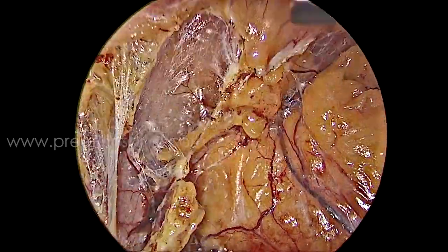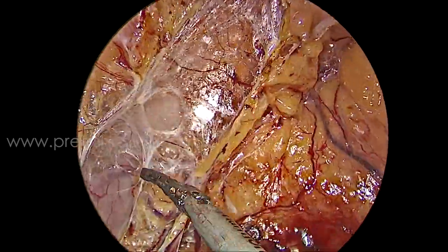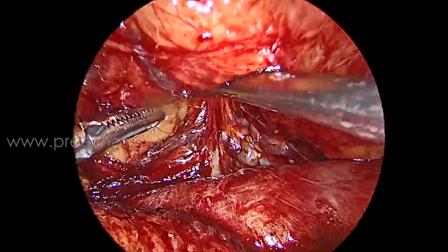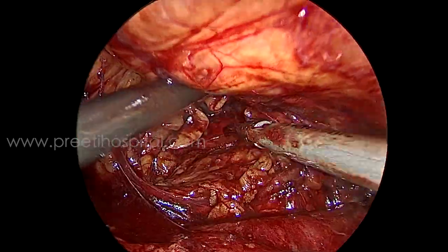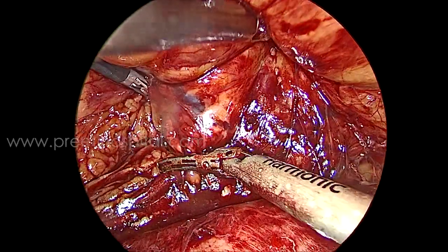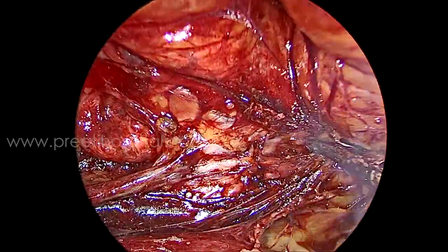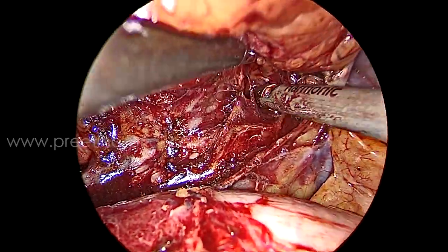All the loose areolar tissue dissected well, nice view, no problem. Identifying the psoas was also okay. Heavy kidney falling to the side was one problem — lifted with one hand and slowly moved. From now onwards a little problem started. This is the renal vein, and here we made suprahilar dissection over the psoas.